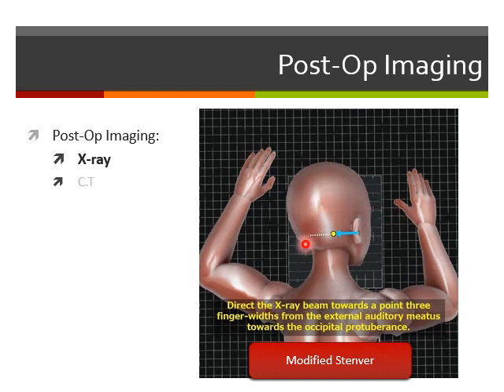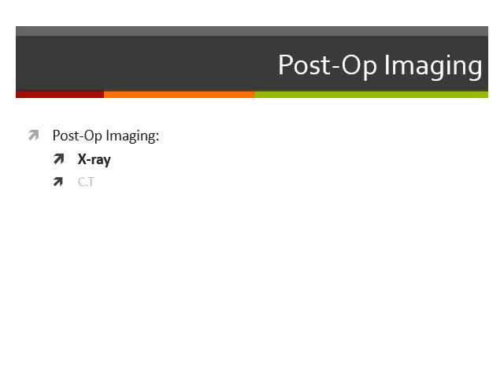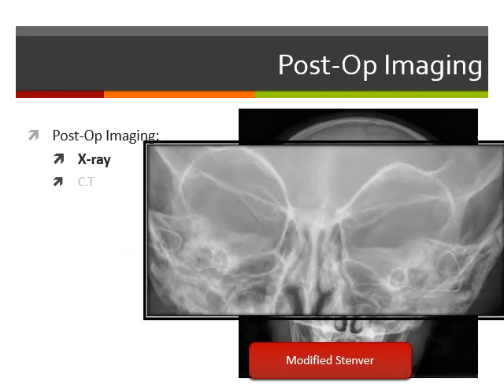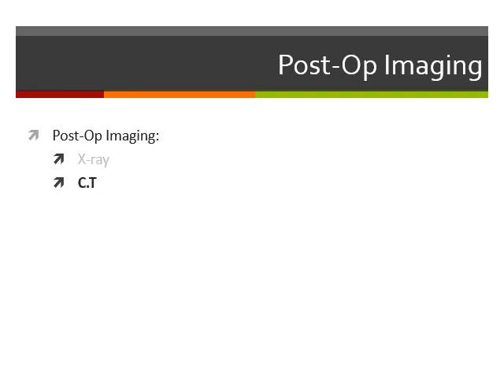So he will bring his left ear, the side of the implant, closer to the detector. This gives us the best image for evaluation. As we can see here, this is the picture. Let's take a magnified view. This is a case with bilateral CI, and both electrodes inside the cochlea can be evaluated.